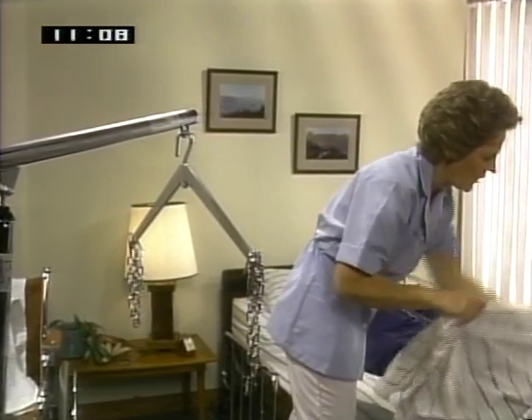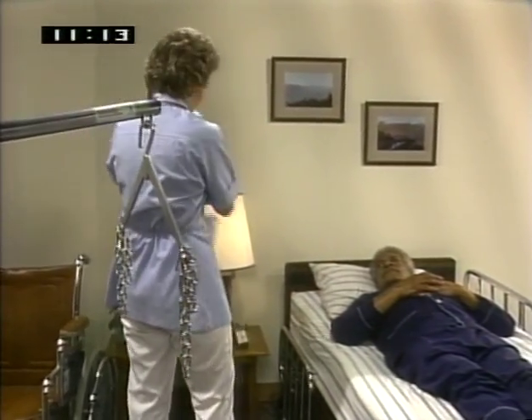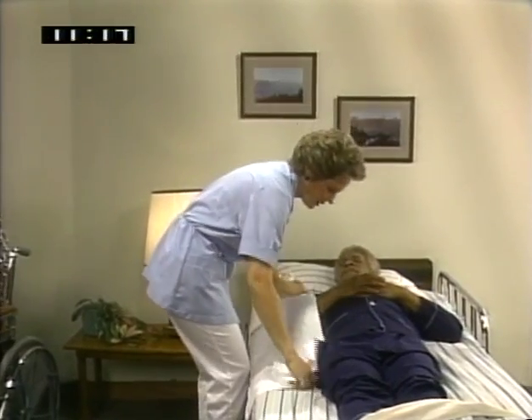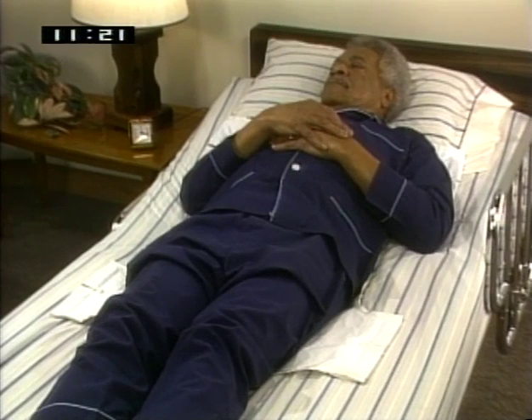The lift is in place with the open end of the base under the bed. Judy also checked that each chain was firmly attached to the swivel bar. Here's the procedure for a transfer with the Hoyer lifter. To position the sling, fold it in half lengthwise. Roll the patient away from you and place the folded sling halfway under the patient, similar to positioning a draw sheet. Turn the patient toward you to pull the sling through entirely.